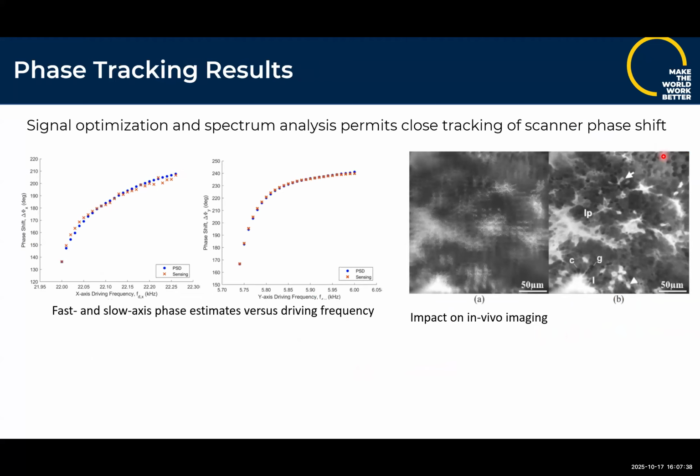Based on the on-chip sensing, while you're running the driver, we can estimate, at least, this doesn't work as well for amplitude, but it at least gives us that phase delay portion. So assuming we're getting a decent amplitude, she could correct this and resolve what was initially very blurry based on calibration of the mirror, and then based on the new phase estimate of what was happening, get a nice clear image of biological tissue.